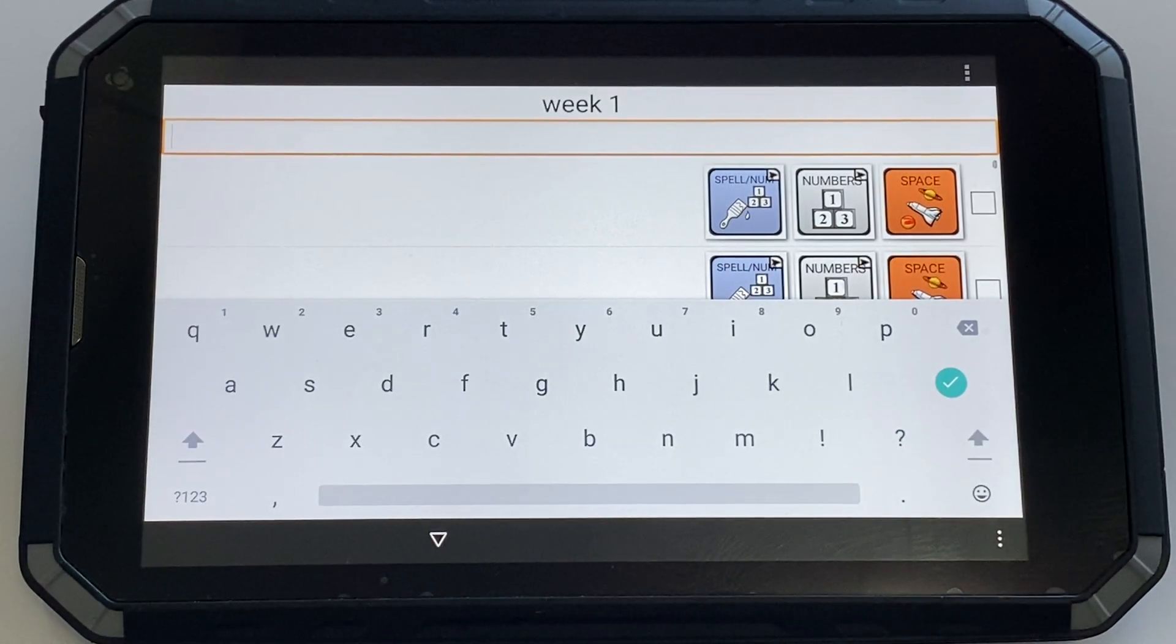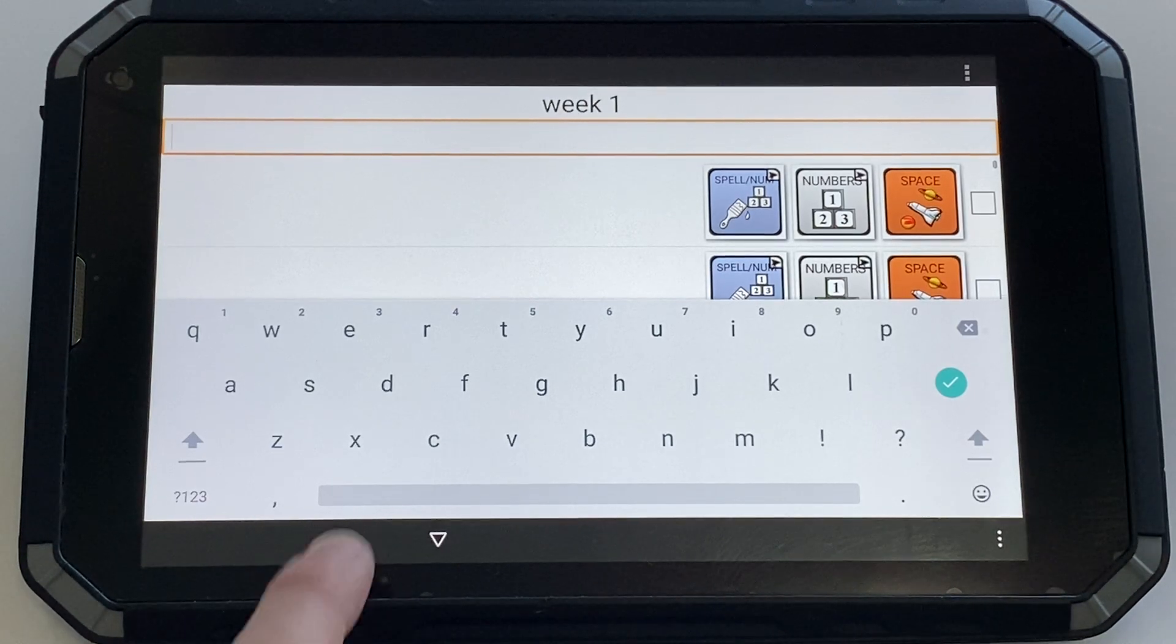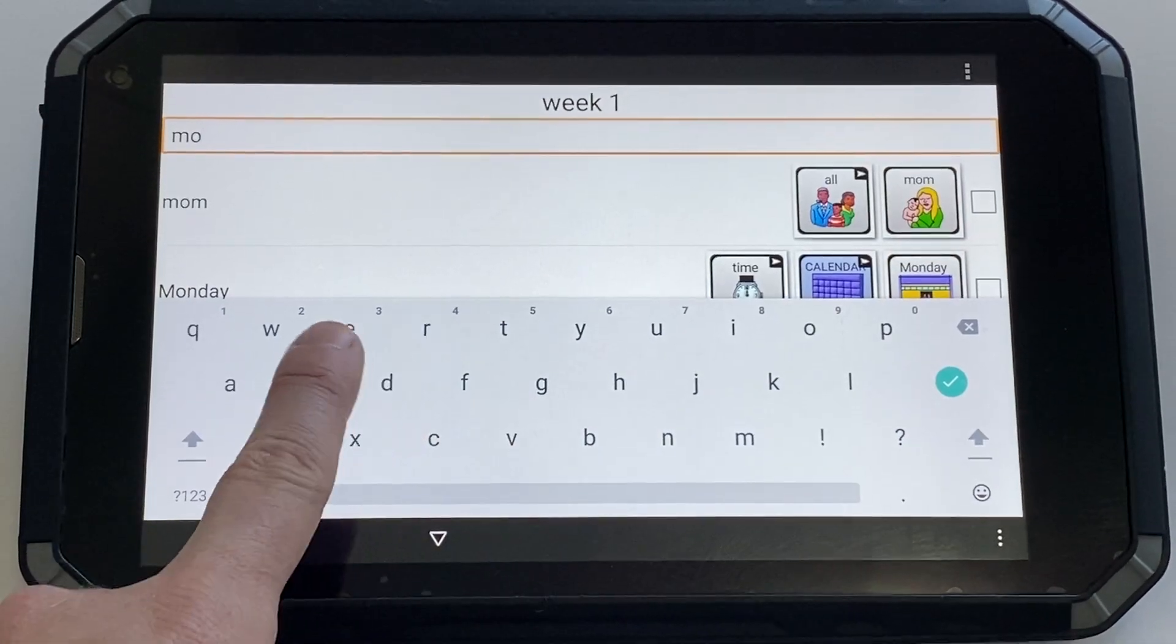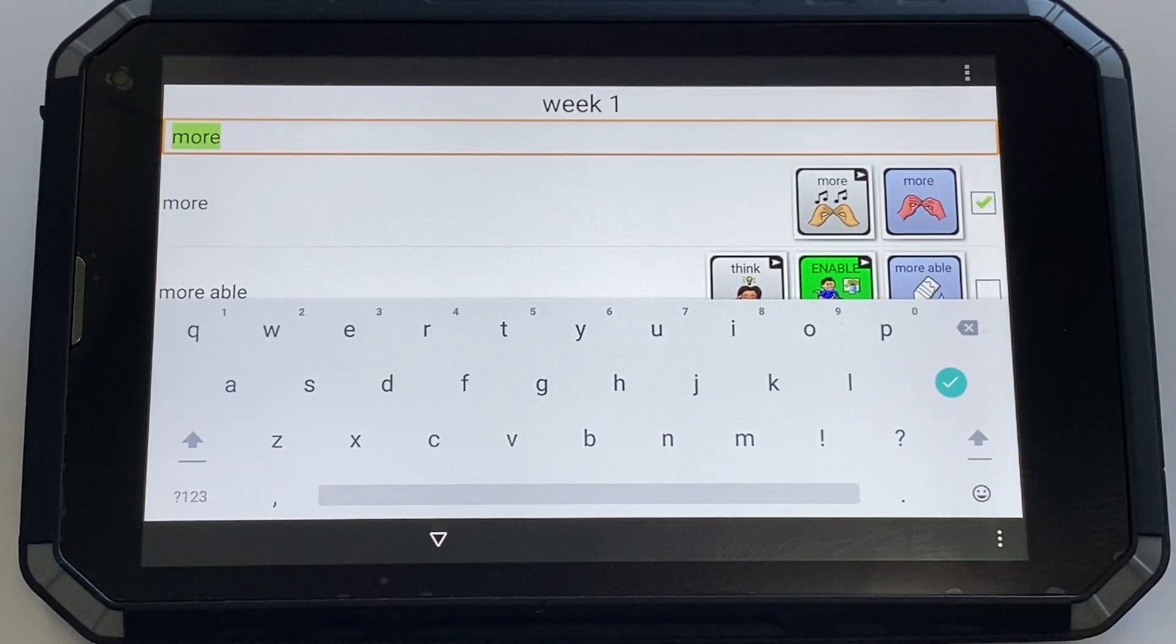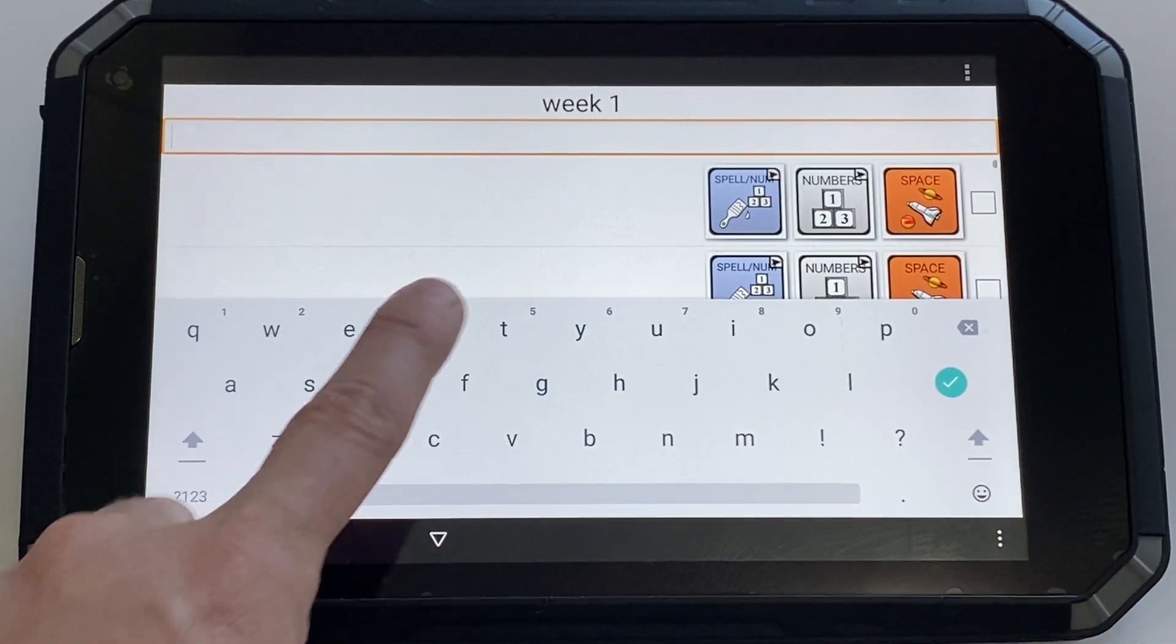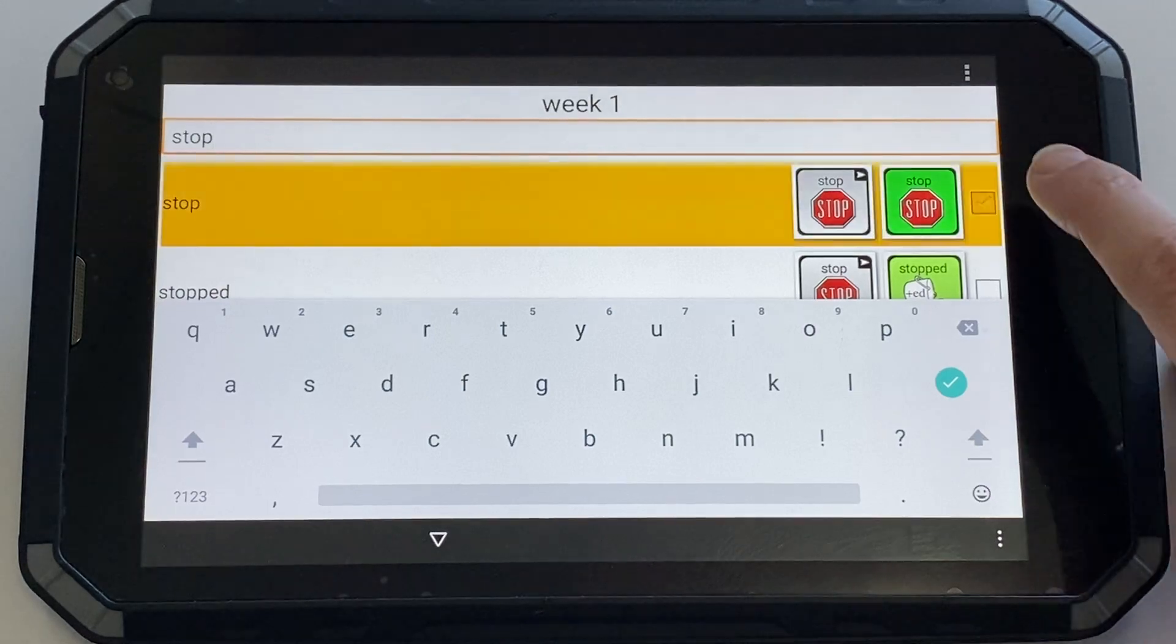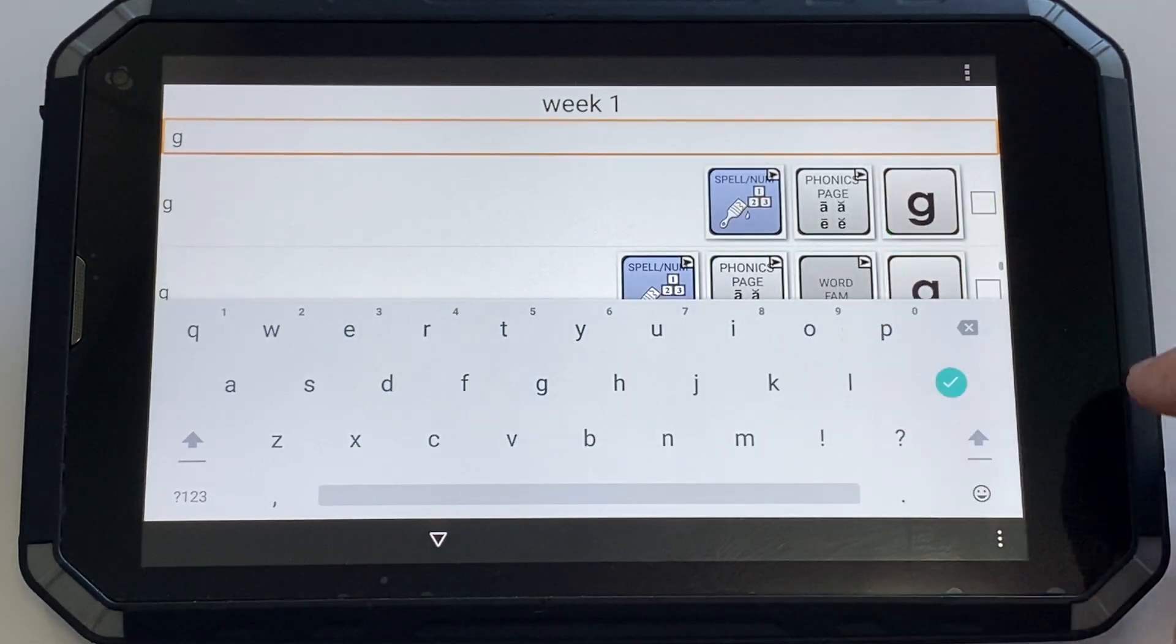From here, you type the word that you're wanting to target and then tap the box to check it. My first target word is more, and I'm going to tap the box. I can clear it. The next one is stop. Continue typing your target words.